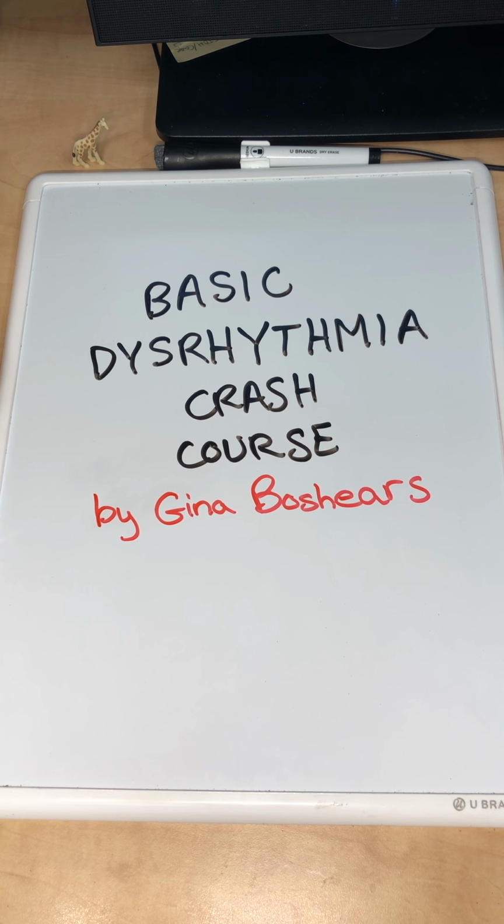I'm just going to give you a brief overview for those of you who haven't seen rhythms in a while. It's by no means an actual Basic Dysrhythmia class. I'm just going to go briefly through anatomy and all the rhythms so that you know what you're looking at when you see a rhythm, okay? So let's start with some anatomy.